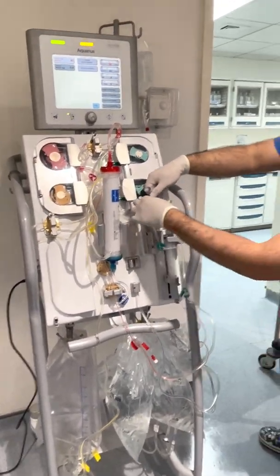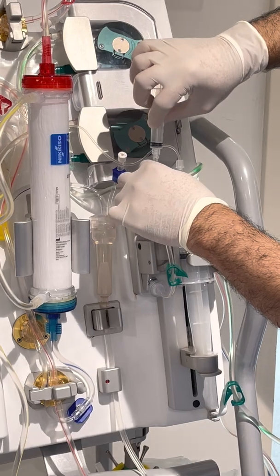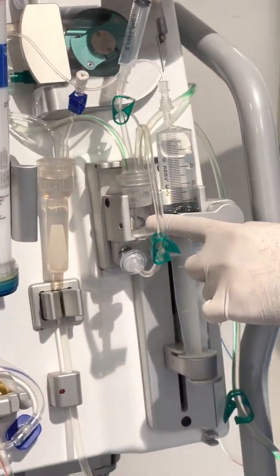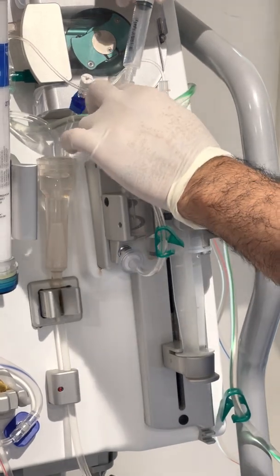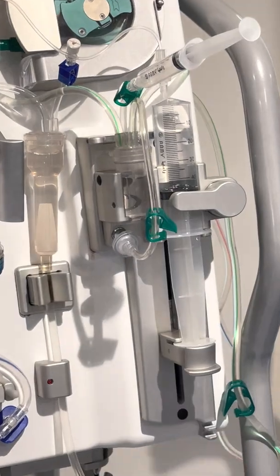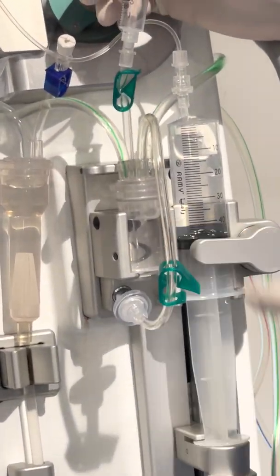Before you open, make sure it is closed. Then open, then aspirate to increase the normal saline here. What is the level? You're asking about the level. Actually, there's no certain level for this, but make sure it is at least 3/4.